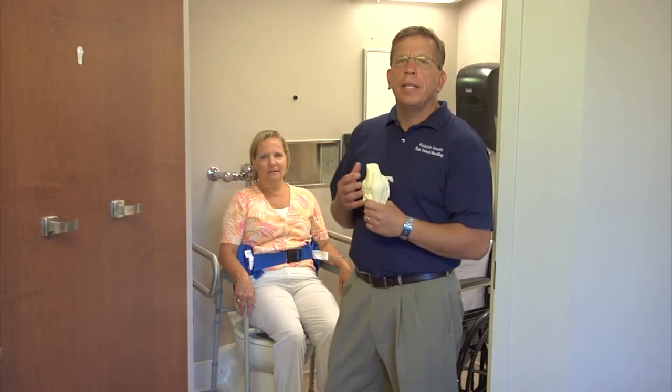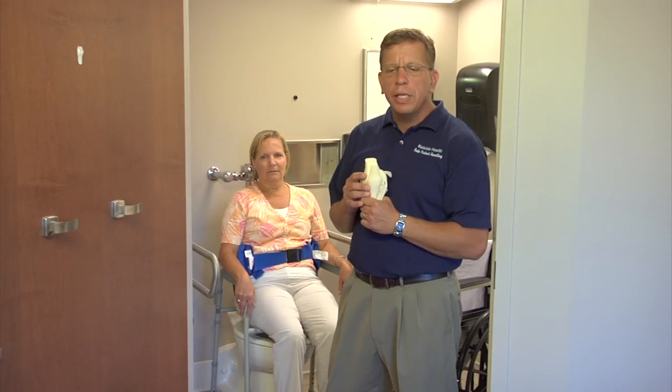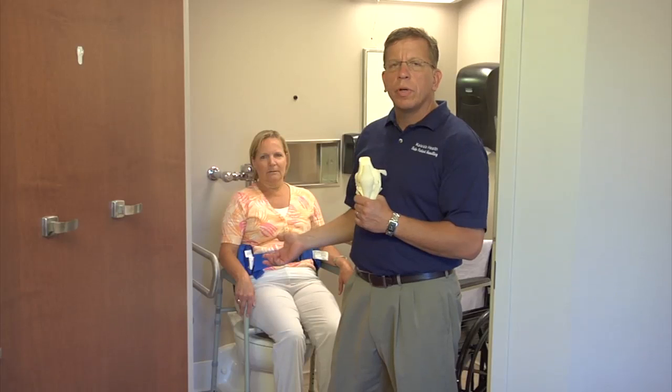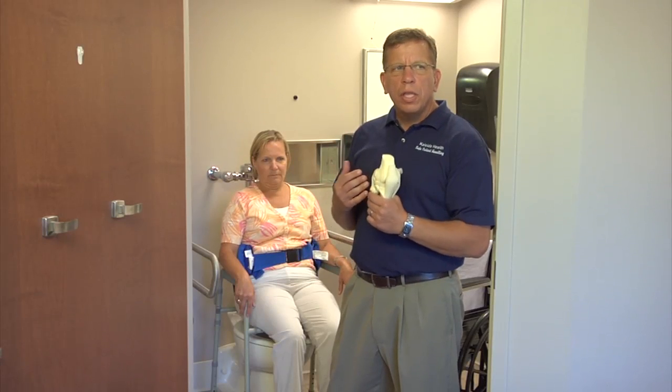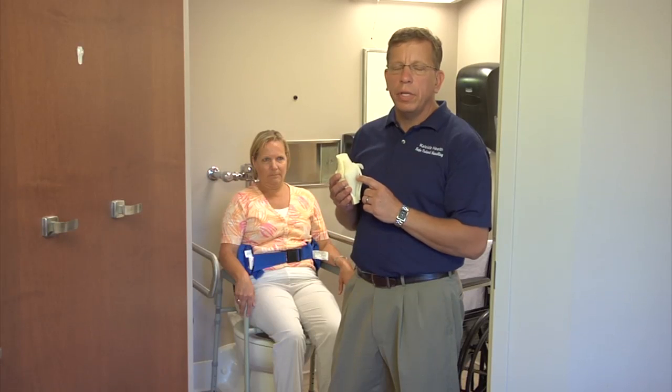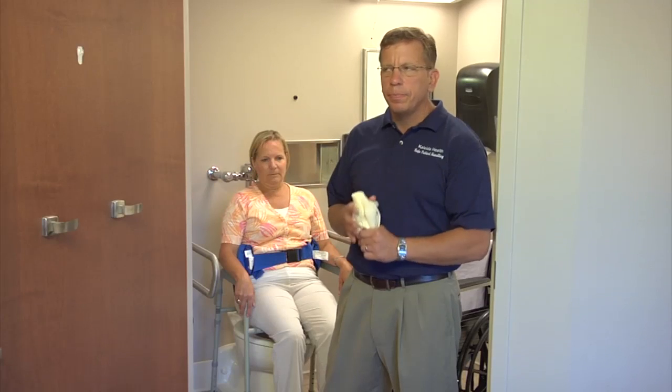Another area in the body that is injured during the stand pivot sit transfer is the knee. We're going to do this transfer, and you're going to see that during a transfer in which the patient cannot move their feet, there's a torsional strain placed on the patient's knee as well as the healthcare worker. This can result in a meniscal tear of the knee in which it doesn't heal, and over a period of time can set both the patient and the healthcare worker up for degenerative changes in the knee joint itself.